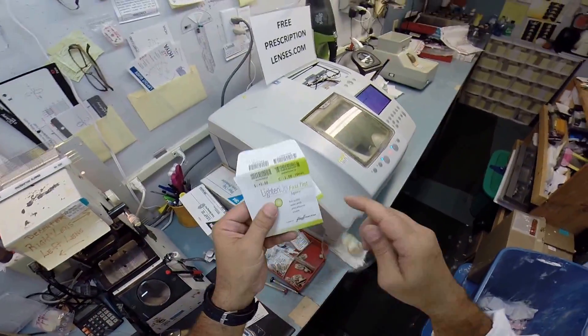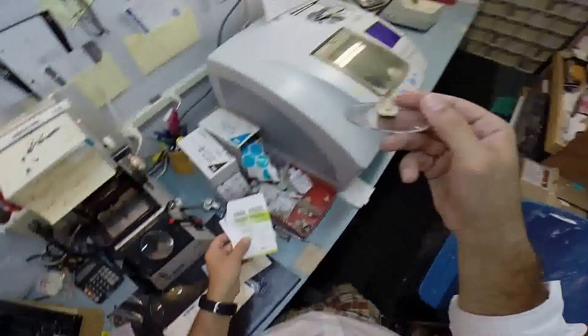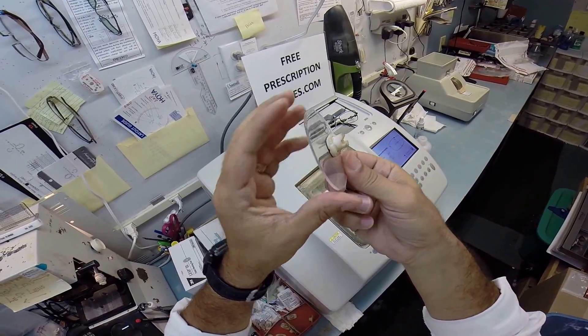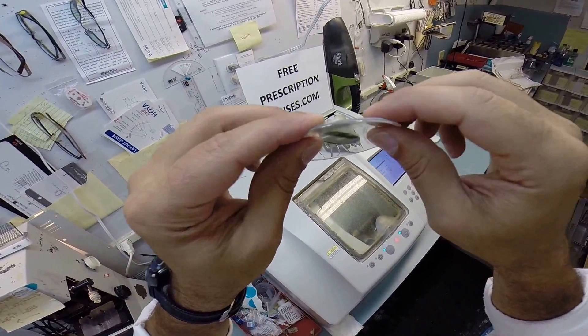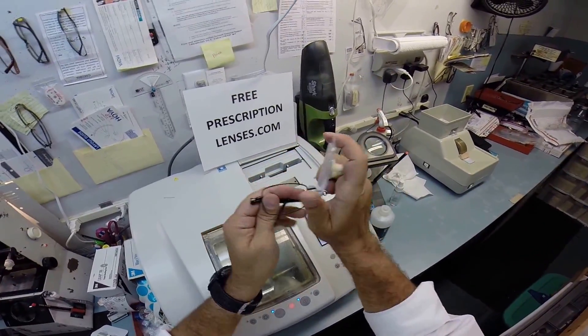Not only is it all that, but it's also aspheric. Aspheric means not round. A round spherical lens gives you that ugly fishbowl cosmetic — that fisheye look. These lenses — aspheric means it's much flatter, much thinner — and it's going to fit best cosmetically inside this frame. No matter how beautiful the frame is, if your lenses are jacked up, you just ain't going to wear them.